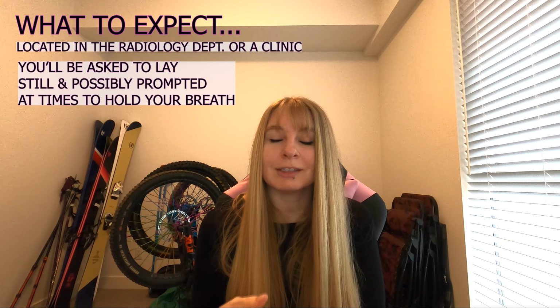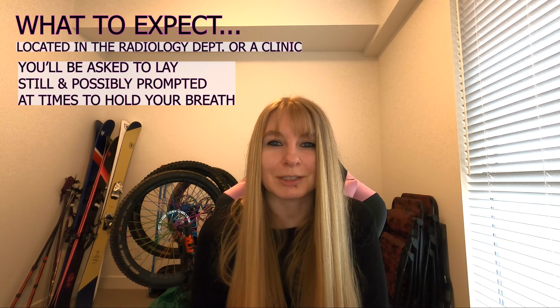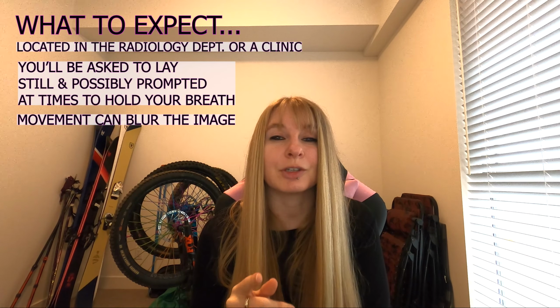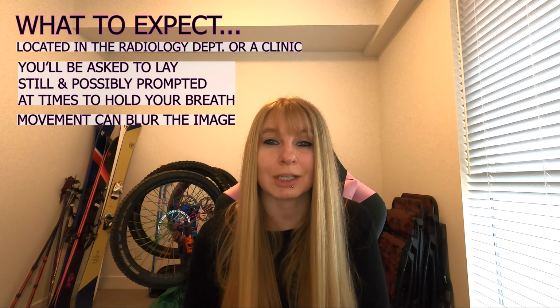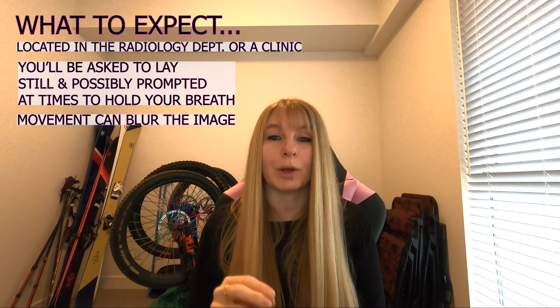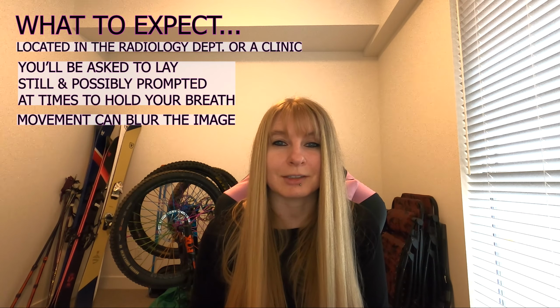For people watching this, I'm guessing you're probably getting lungs scanned if it's pulmonary embolism, so expect to have to hold your breath when prompted. This is because movement can cause the image to blur, which is what we don't want, so staying still is key. The last scan I had a few weeks ago had an automated prompter as part of the machine. So a computerized voice told me when I was in the CT, when to hold my breath and when I could breathe again. It's not for very long, I would say no more than 3 to 5 seconds max.